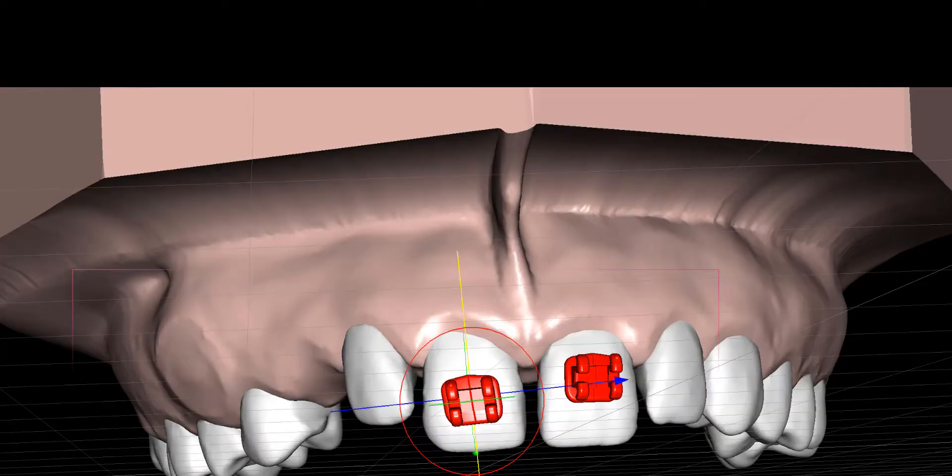There is also variability in the angulation. You can slightly vary the angulation. I would argue that this is a bit too much. This is good.